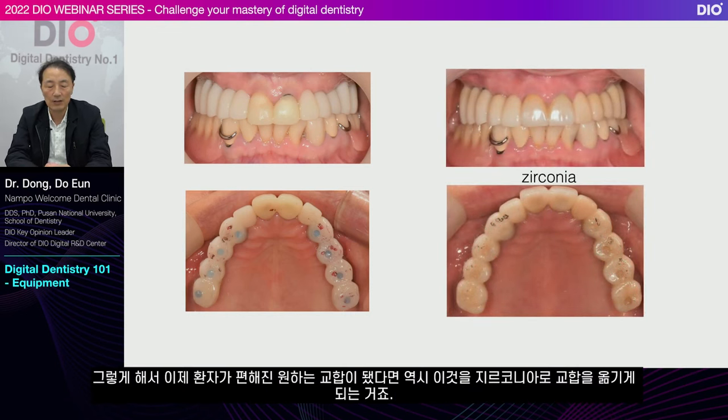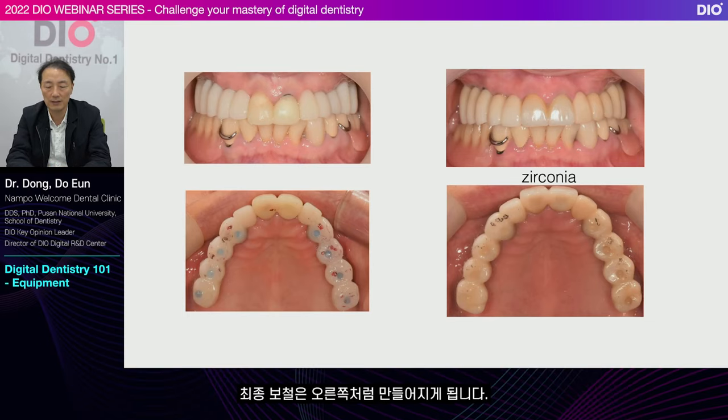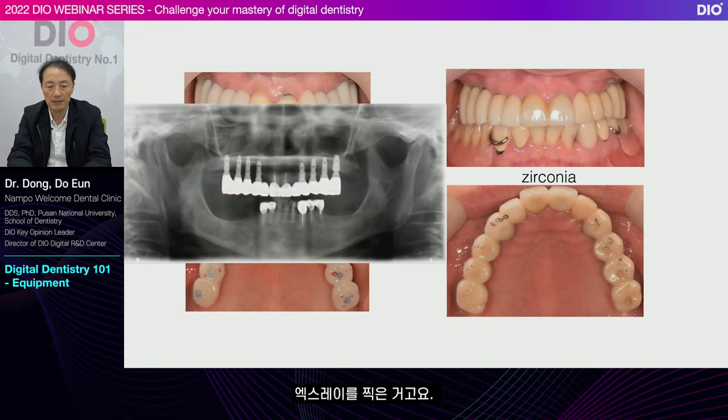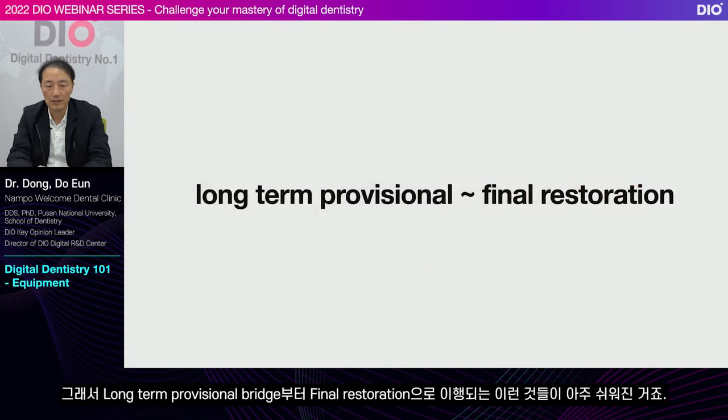So if the patient finds the occlusion that's comfortable, this gets transferred to the zirconia. The final prosthesis is made like so on the right. This is an X-ray. So switching from long-term provisional bridge to final restoration became very easy.